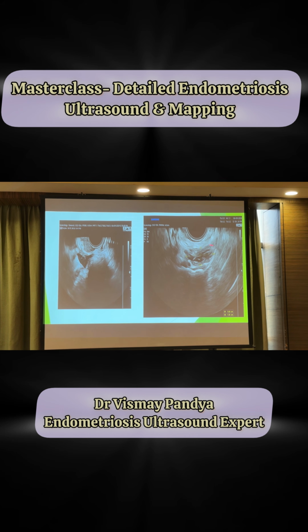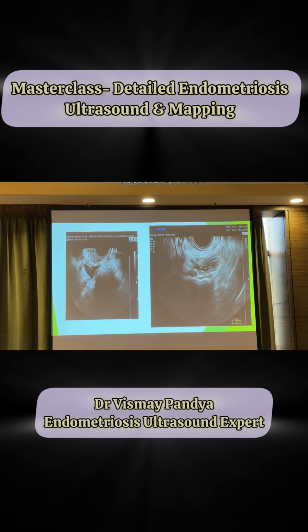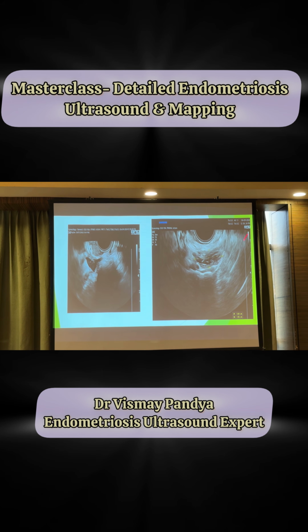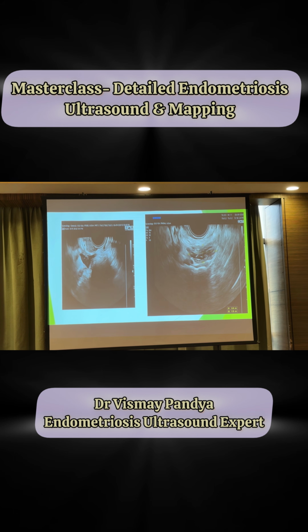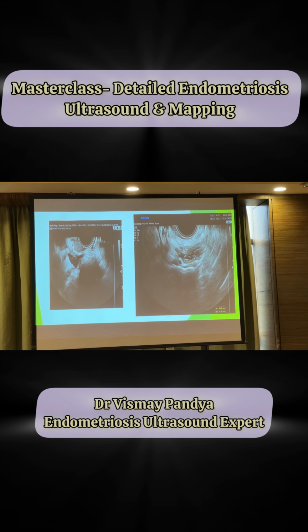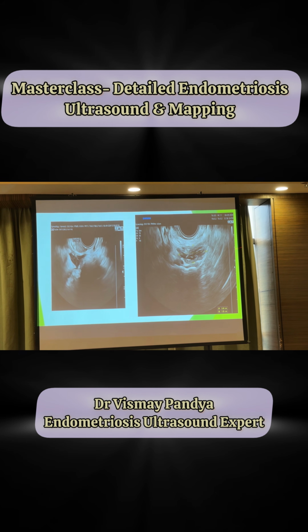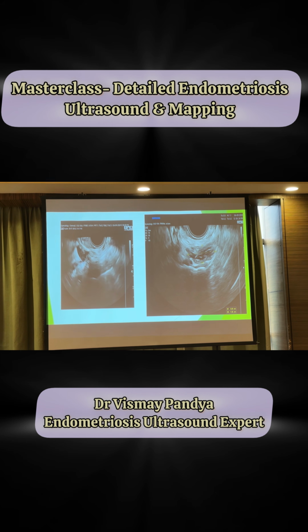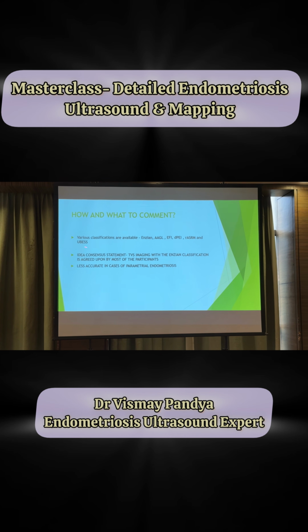Like this nodule I diagnosed recently in the lateral pelvic wall. Here, the bones and the piriformis muscles come in. So it is very, very lateral to the uterosacrals. Essentially, you are looking at empty spaces. There is no landmark here, so you can very well be diagnosing something non-specific, and it very well could turn out to be a negative laparoscopy.